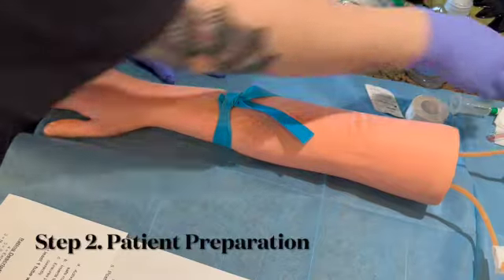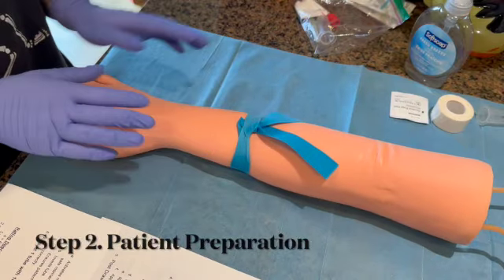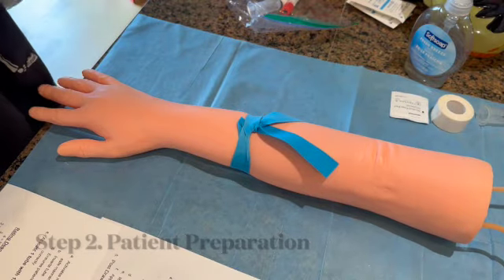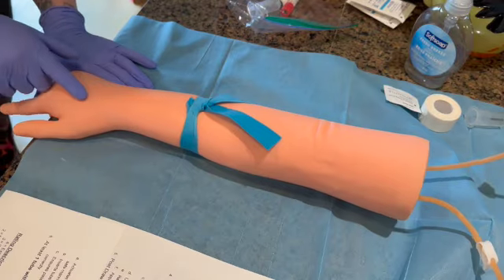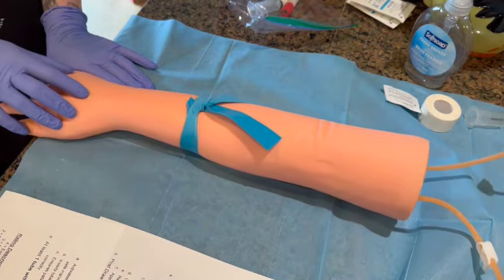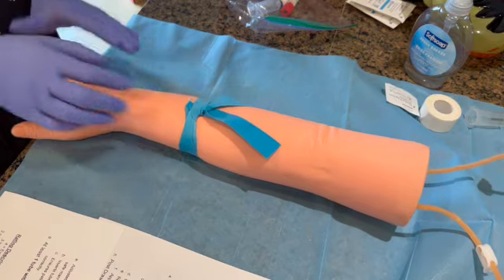There we go. Oh gosh. We've got Robert's tourniquet on here in the appropriate location per this draw. And we're going to select the site that we want to utilize for his hand draw. I think I'm gonna go into this vein right here because there's a nice soft spot for me to enter into. I do like this one though as well.